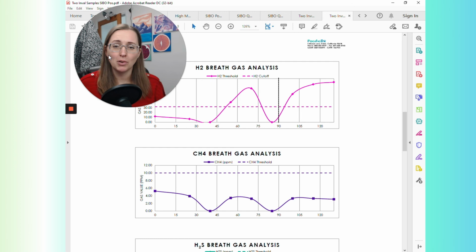So I hope that this was helpful for you. I definitely am a fan of this test, but there needs to be some really careful thought and consideration when you're interpreting it, and please double check your clinicians. Again, a lot of them either are not super familiar with SIBO, or they're just going to listen to the lab's interpretation and run with it. And I think that you really want to double check that you're getting the proper interpretation of this type of a test, certainly before you do prescription antibiotics, but also before you embark on round after round of oregano or berberine or whatever it might be. Please, please, please make sure that this was interpreted correctly, and make sure that you get the appropriate diagnosis before you go in guns a-blazing and potentially really wreck your microbiome.